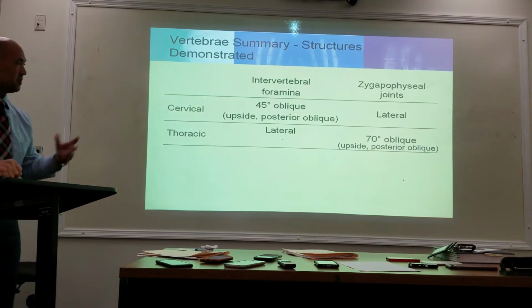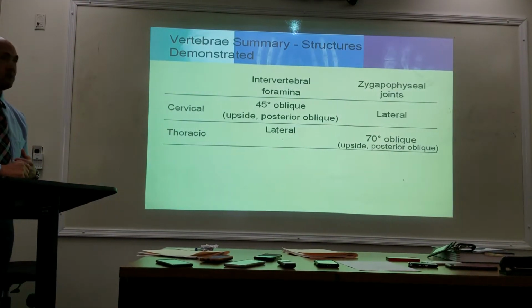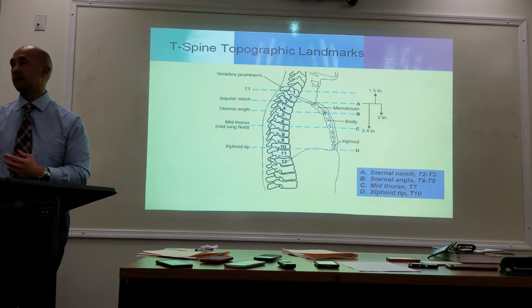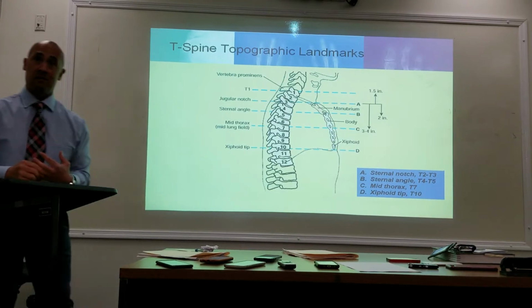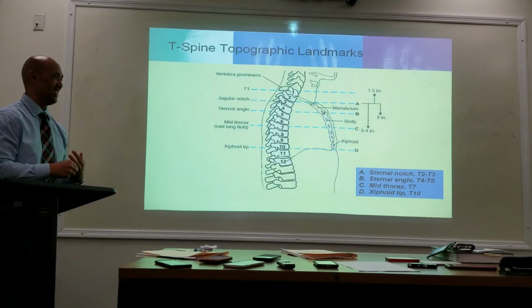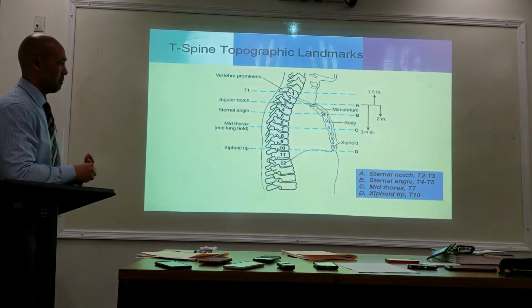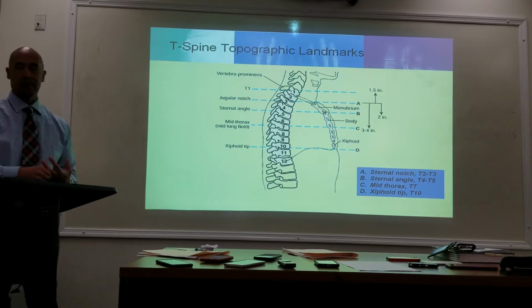All right. This chart here should be very, very helpful. By now, you should know your landmarks. Should. So please review your landmarks again, because we are going to use these landmarks for these positions.